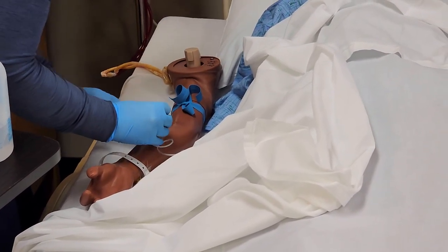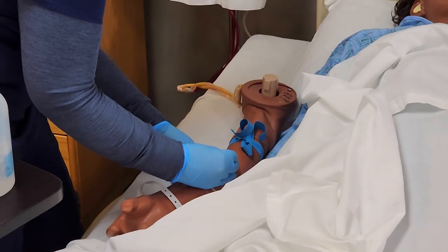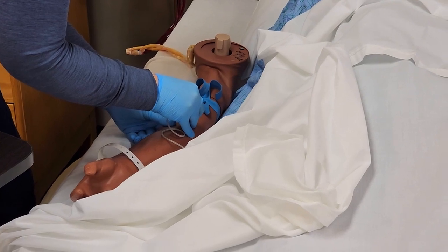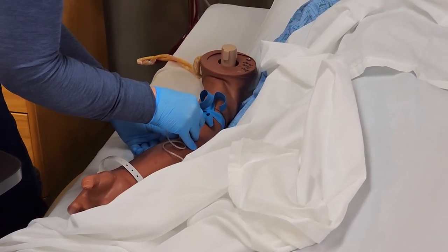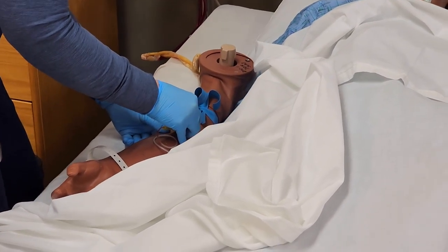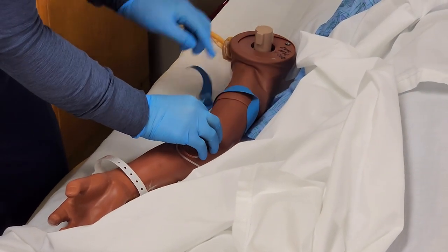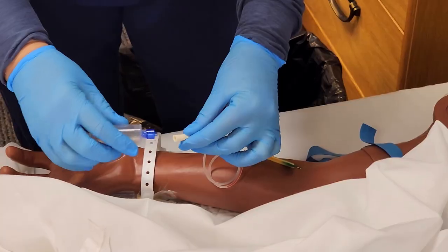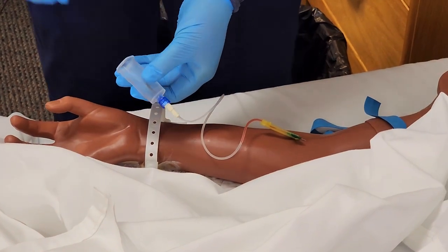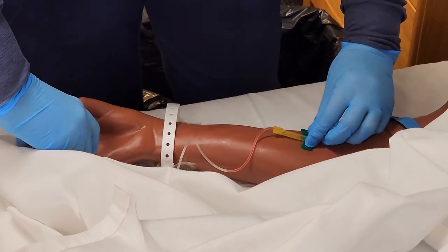Stabilize the vein using your non-dominant hand with your thumb, then go into the vein. Make sure the patient is aware they'll feel a stick or a little poke, and insert at a 30-degree angle. Once you get blood, advance just a little more, secure the needle, attach the vacutainer, and start filling the blood tubes.